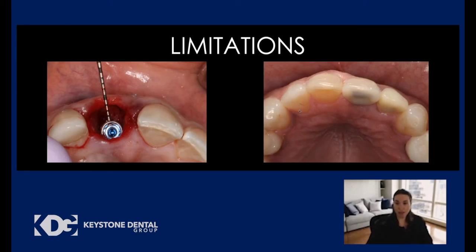The other limitation that we have is that our restorations were cement retained and not screw retained. So it was maybe a little bit more difficult to shape the tissues. However, we try to compensate on that by doing the provisional restorations or the customized healing abutment with everything that I discussed before to try to maintain that tissue in place and try to stabilize that tissue in place.